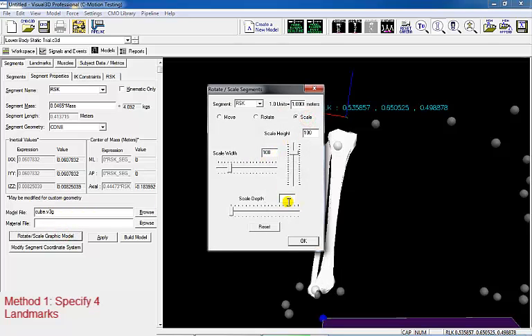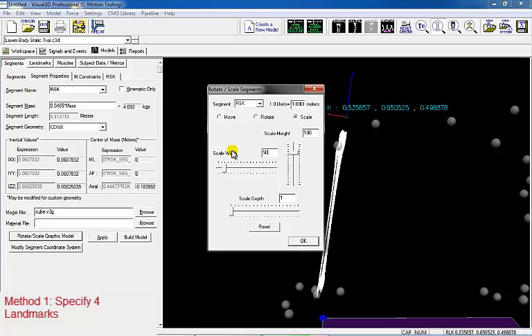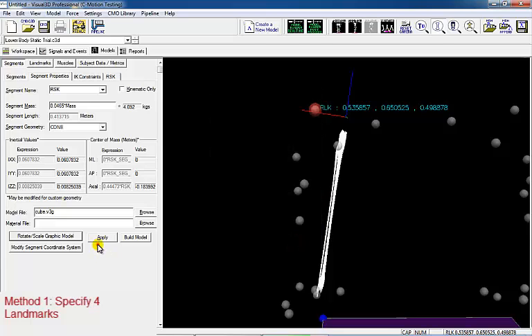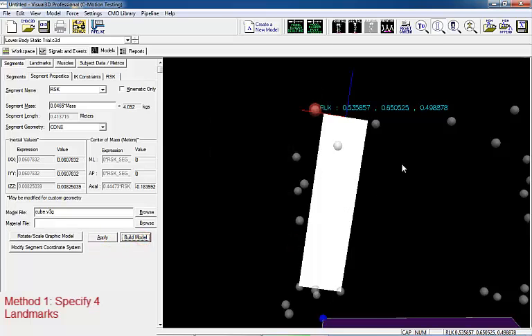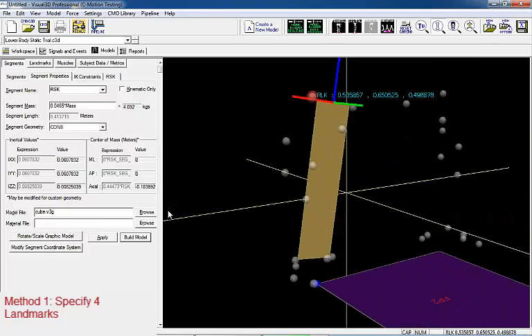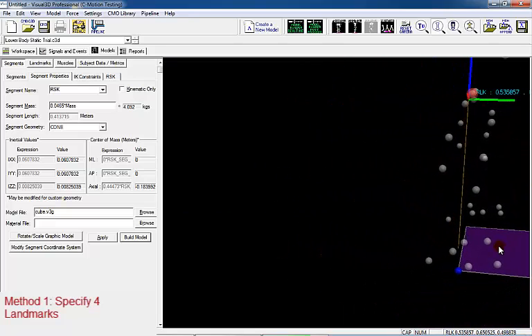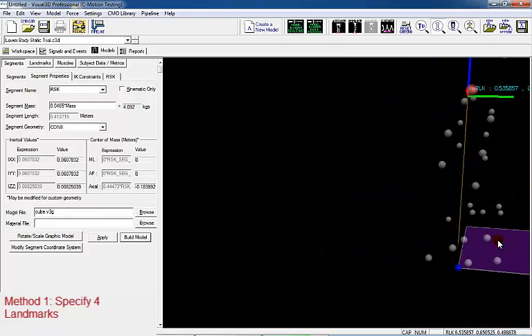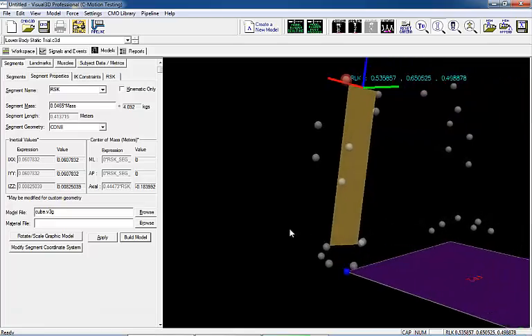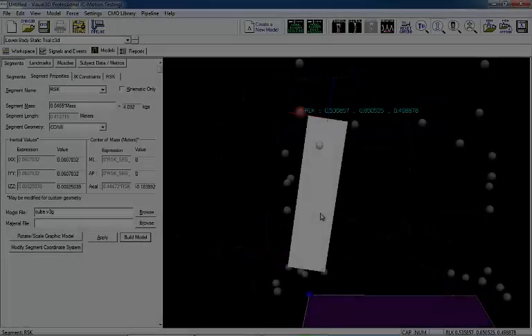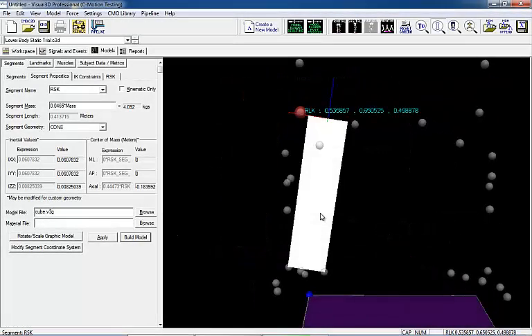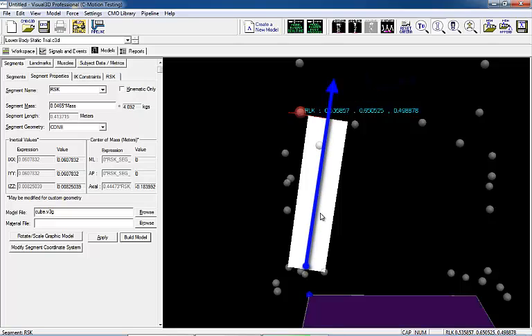Set the model file to cube and the scale width to 50 and the depth to 1. We can see the plane lies in between the knee and ankle markers. Now that the plane is defined, the z-axis, indicated by the blue axis, is defined along the distal to proximal end of the anatomical plane.